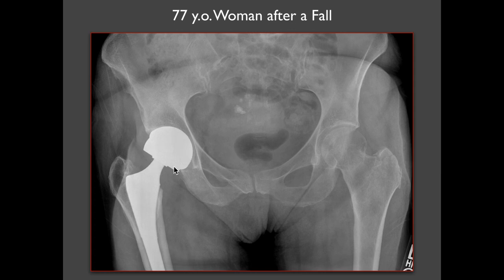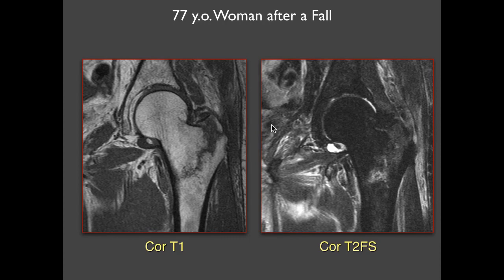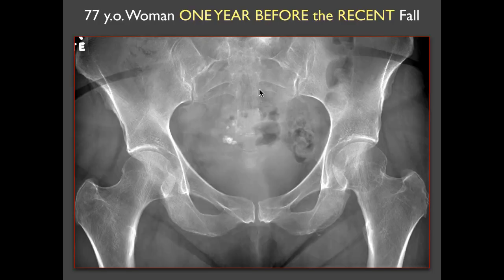This patient has had a hip replacement on the right side — forget about that for now. What about the left hip? It shows a little angular abnormality of the femoral head-neck junction suspicious for a fracture, and there's a subtle lucency across the greater trochanter. MRI on this T1-weighted image shows a low signal line in the intertrochanteric region with corresponding edema on T2. The femoral head-neck junction is actually normal, so the subcapital region finding is an old fracture — the intertrochanteric one is the acute fracture. Treatment for those will differ in terms of hardware placed. Always look for old films — this patient had images from a year before confirming the subcapital fracture was old.